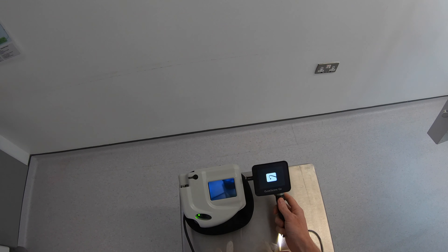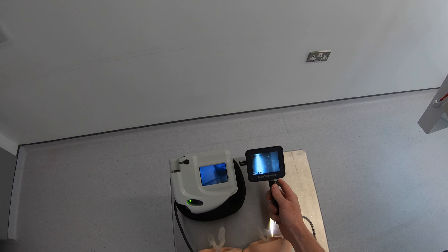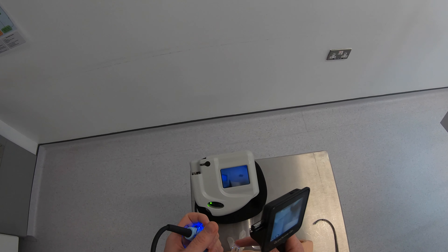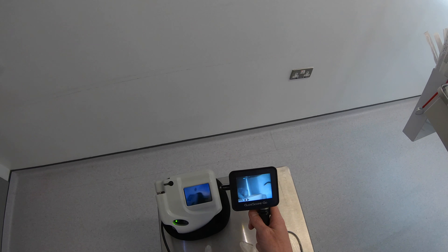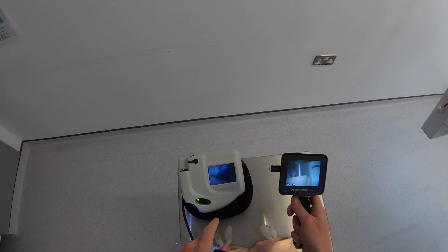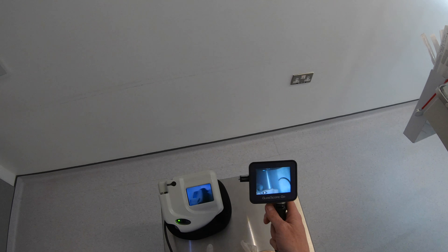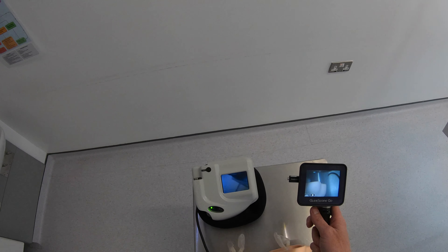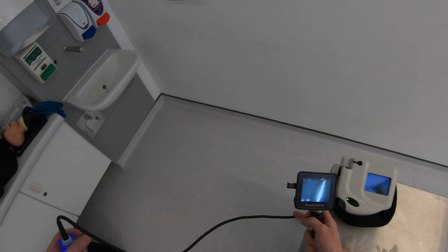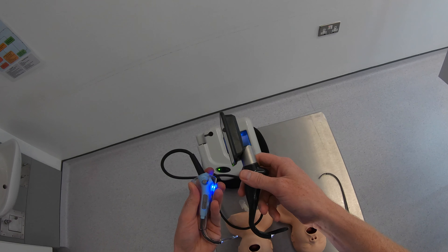We'll power the two devices up and have a look at the screens side-by-side. The screen size is fairly similar. One thing I noticed straight away is on the old system you can't actually see the stats, whereas on the new system you can see the stats at the top of the screen — that's a great new addition. I can see how much battery I've got left on the Go; I can't see that on the Ranger. And I've got recording function on the Go, whereas the Ranger has no ability to record. The other nice thing with this is it's hands-free with no connecting cables, whereas the Ranger has a big long connecting cable.